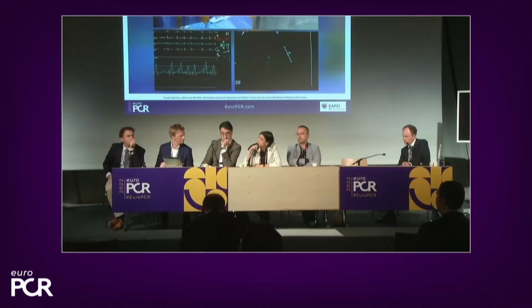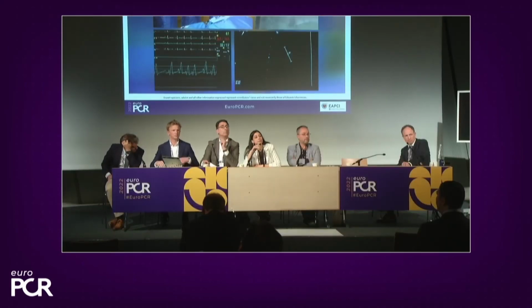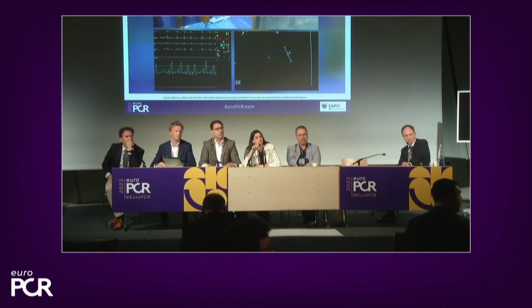Okay, so maybe one last question. Yeah, there's a question. Go ahead. Just wanted to ask you, what is the rate of complications here? I mean, overall complications, let's take 100 patients.